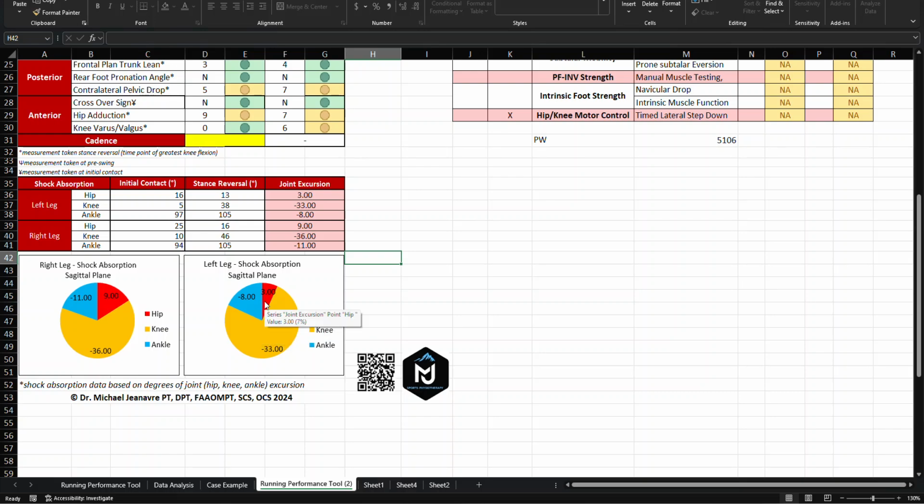My suspicion, and it is only that, a suspicion that would need to be tested out, is that I would be interested in looking at peak force production in the sagittal plane for each of the major joints, as well as the power production relative to body weight. In this case, I'm expecting potentially to find an asymmetry from left versus right because of the discrepancies that we see in the left versus right leg.